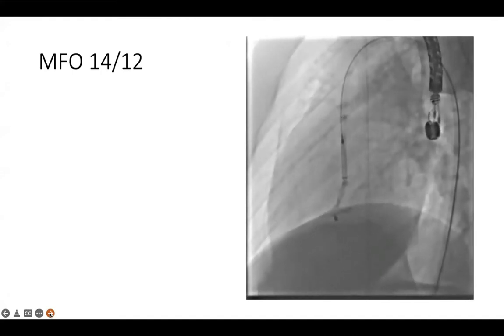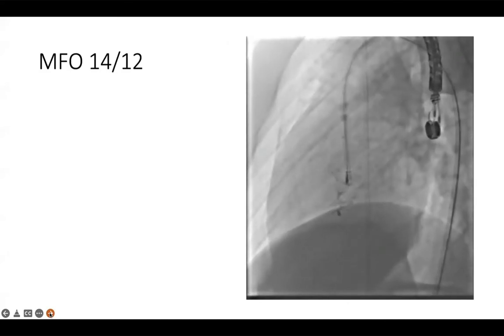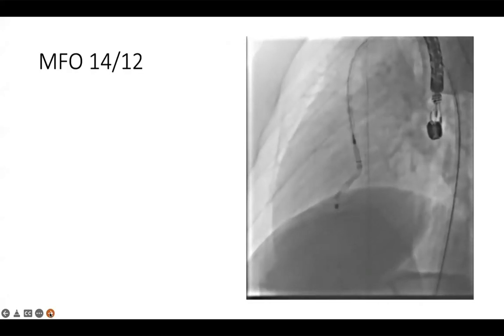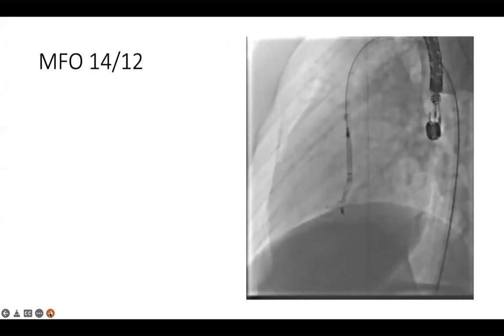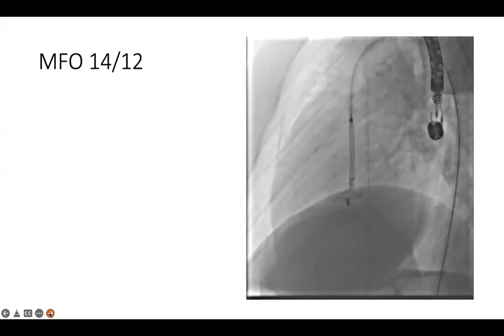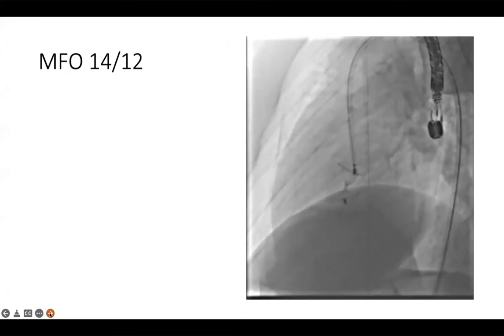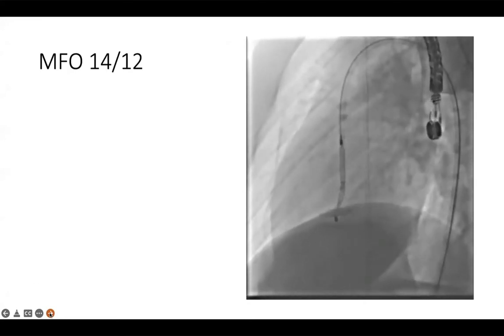So what's interesting, and I think it gets back to the conformability of the device, this is what we used to start with an MFO. So we used the biggest MFO we had to see could we achieve it, and I think that can be delivered through a 7 French sheath. This may well be a Terumo Destination sheath, because we quite like its hydrophilic properties. Although I would say that the sheaths that come with the MFO really are quite good and a reasonable profile.